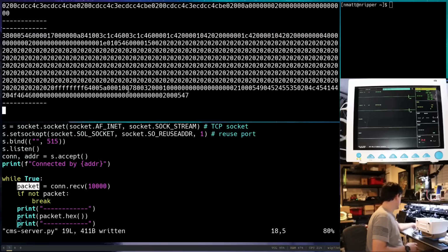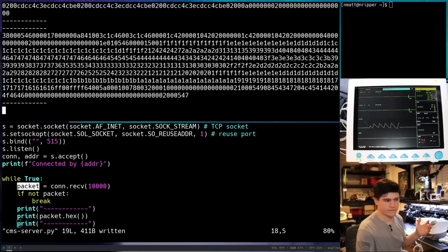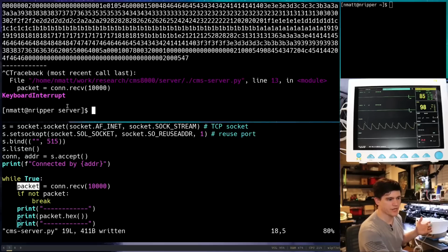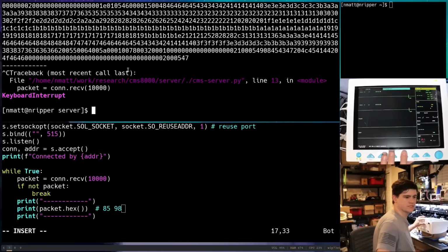And I'm going to once again take a reading. And then we're going to get ready to Ctrl+C it once we have steady data. There we go. Okay, 85 and 98. 85 and 98. Okay, what do we want to look for? An 85 and a 98. Awesome. Patient monitor. Silence.